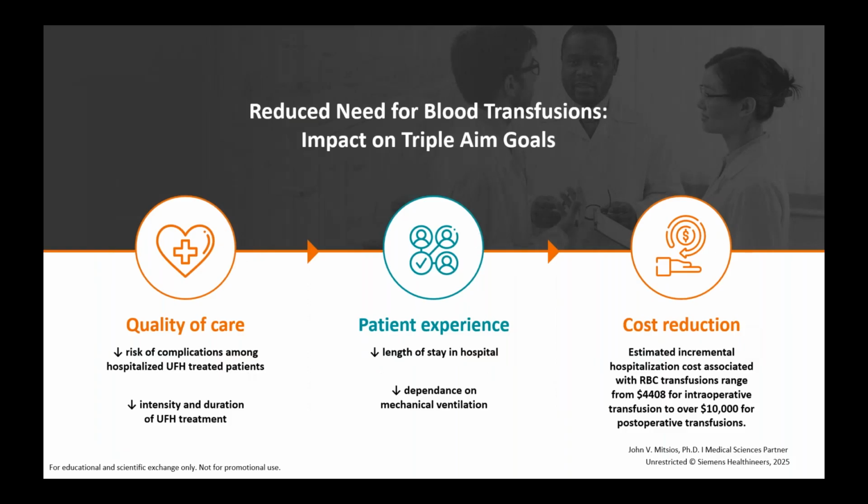So collectively, when we think about the triple aim of the study that I just presented, it improves quality of care, because there's decreased risk of complications among those patients that are hospitalized and being treated with unfractionated heparin. There's a decrease in the intensity and perhaps the duration of unfractionated treatment because you're getting to that therapeutic window faster and allowing those patients to be properly anticoagulated.